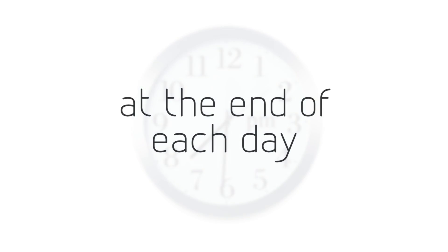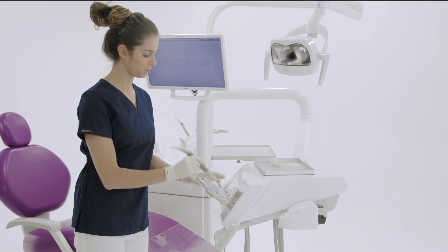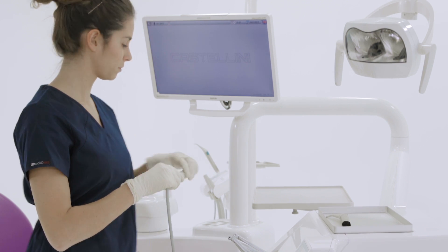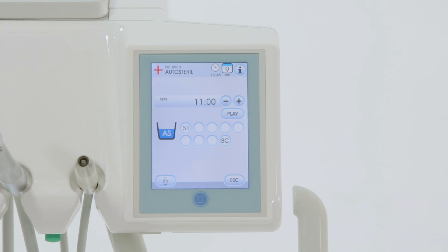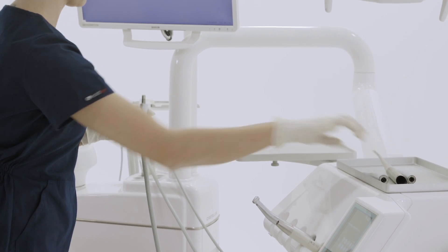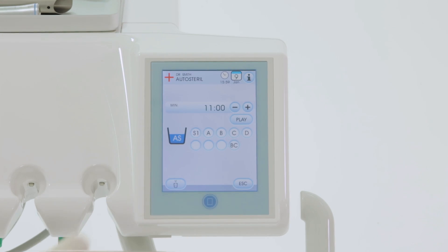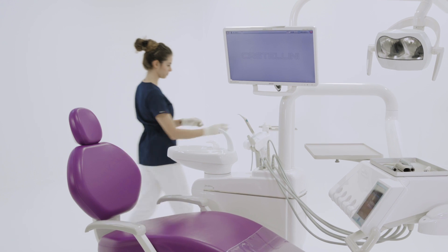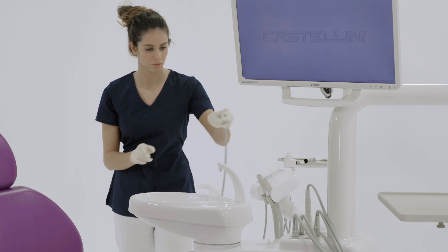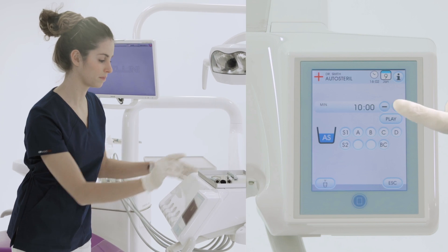Other operations are recommended at the end of a workday. From the full-touch control panel, the assistant prepares to run the auto-sterile cycle before removing the instruments. Then the instrument hoses are placed in the especially provided tub. The assistant ensures that the nozzles are fully open. A personalized running time can be set. Press play to start the cycle.